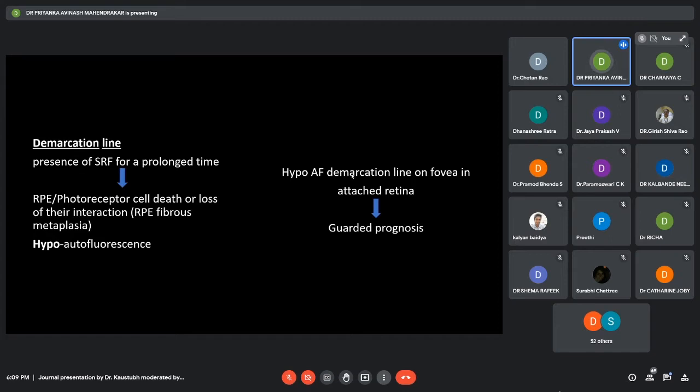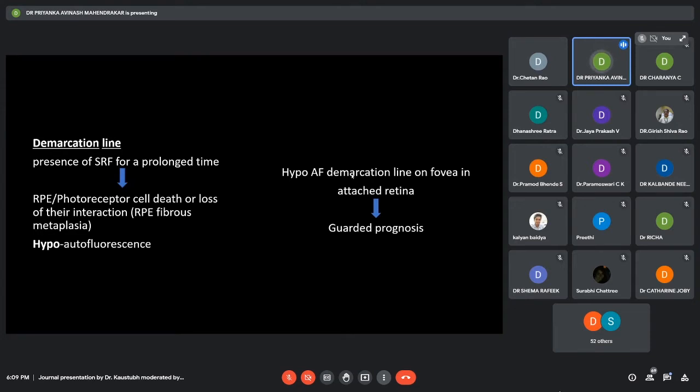The clinical implication is that the location of the hypo-autofluorescence, after getting to know the location of this demarcation line, we can actually know what the prognosis of the retinal detachment might be. Like, if it crosses the macula or the fovea, we know that there is going to be a guarded prognosis in these cases.